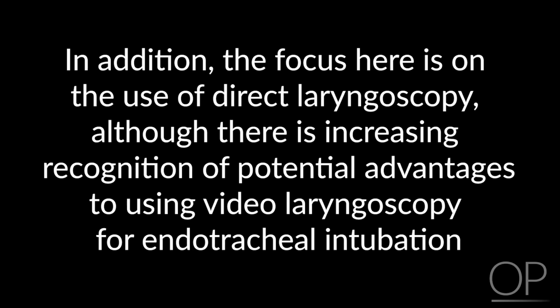This video will not cover bag mask ventilation or predictors of difficult airways. In addition, the focus here is on the use of direct laryngoscopy, although there is increasing recognition of potential advantages to using video laryngoscopy for endotracheal intubation.